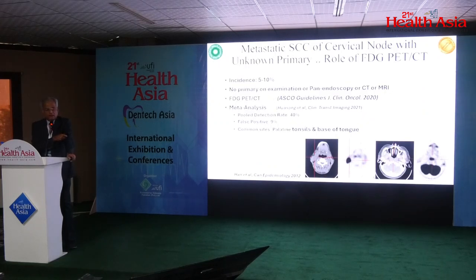Metastatic squamous cell carcinoma of a cervical lymph node of unknown primary is seen in 5 to 10% of patients. As Professor Farooqi has mentioned, in such patients the primary tumors are usually not detected on clinical examination, panendoscopy, and cross-sectional imaging. Therefore, the American Society of Clinical Oncology guidelines, published in 2020, recommend using FDG PET-CT in SCC metastatic lymph nodes for the detection of the carcinoma of unknown primary.